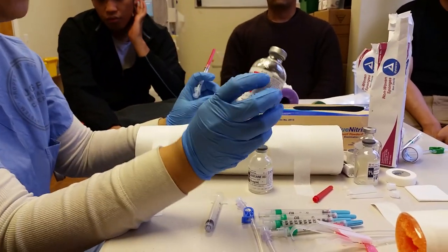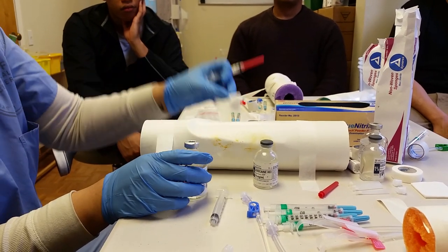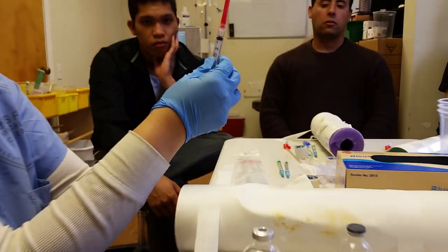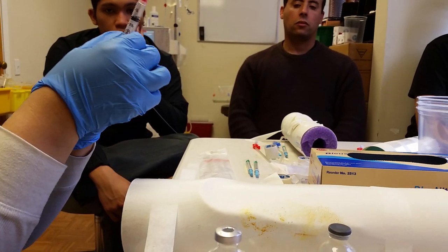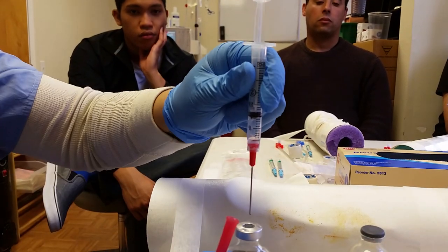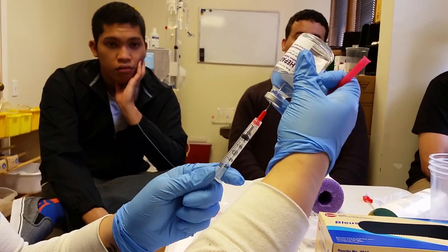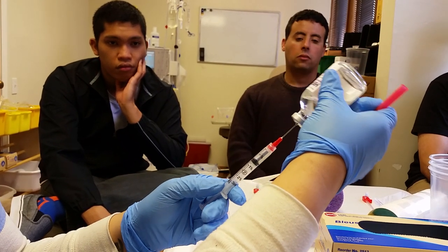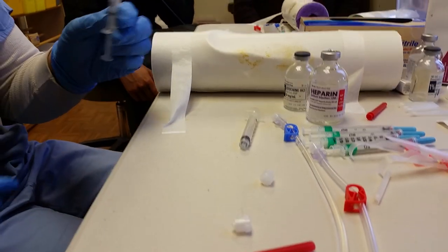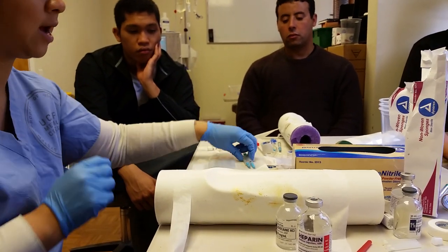If the heparin's already been opened, you always want to clean the top with the alcohol swab. My technique for drawing medication is I pull back — let's say the patient's a thousand units — so I pull back one. Then I put air in and aspirate. This kind of lessens the chance of getting bubbles. This is the wrong way to cap the needle — this is the way you're supposed to cap the needle. So you have your bolus ready, and then now for the lidocaine.